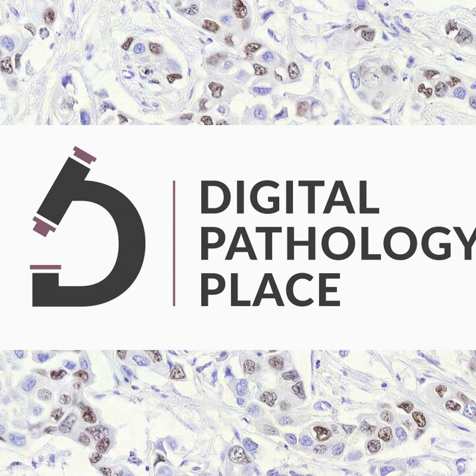And it's made it a lot simpler to develop new applications, which can now be handled by the researchers themselves. And they can develop these applications just using a simple teach by example if they use AI. So AI has evolved image analysis, I would say, from a science, sometimes even an art form, to a craft that can be used by an application domain specialist. And that's, I think, a new development.